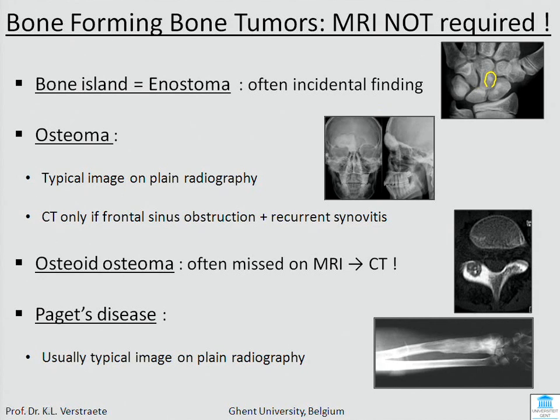The second tumor we have seen was in the head and it is an osteoma. An osteoma is a bone forming tumor — very compact bone, it's white, it's a typical image. You often find it in the frontal sinus and you just need CT if there are complications. The other one you will often miss when it's in the vertebra on an X-ray because it's hidden — it's the osteoid osteoma. You don't need MRI; CT is better to find the nidus.